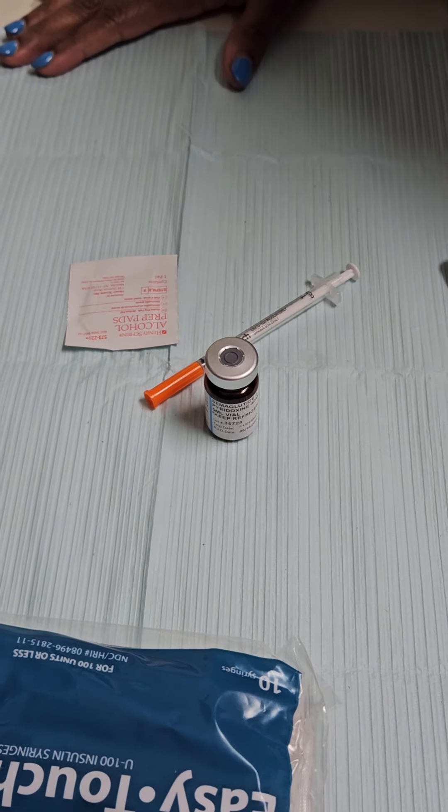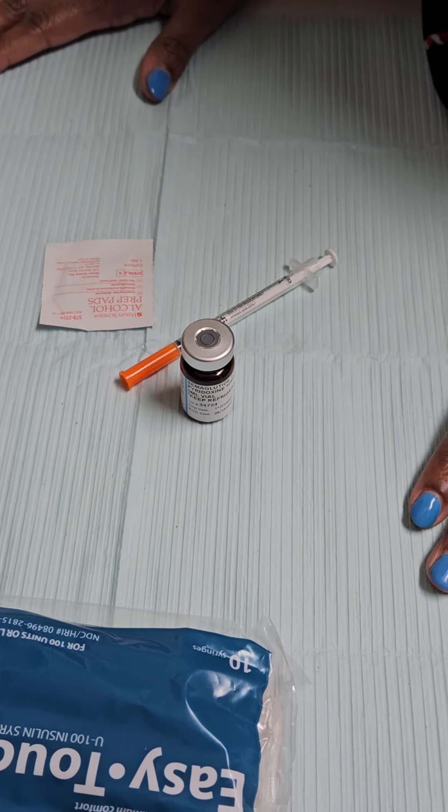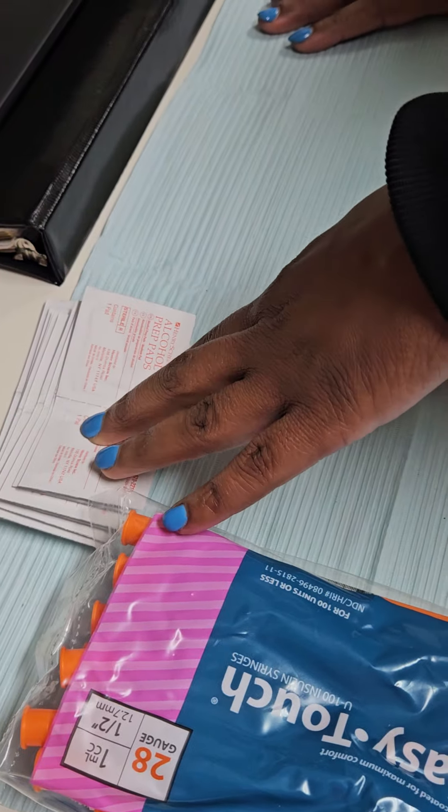Hi guys, today we're going to teach you how to self-inject your weight loss medication. When you receive your medication at home, you'll receive your insulin needles and your alcohol prep pads.